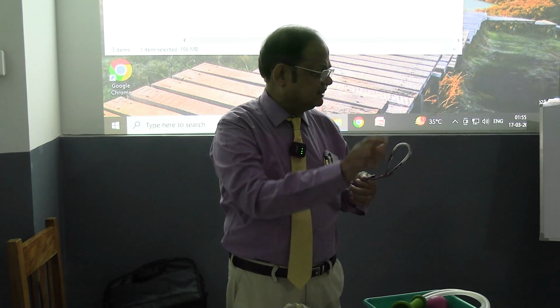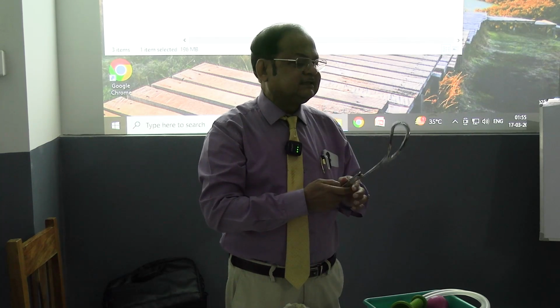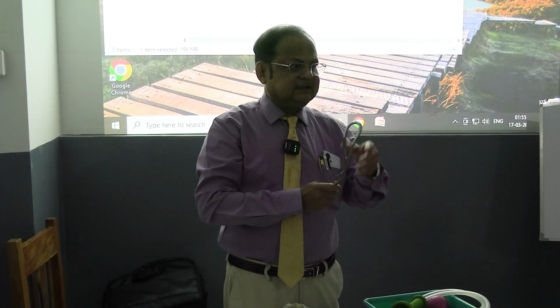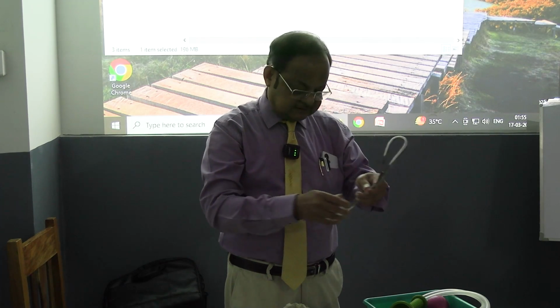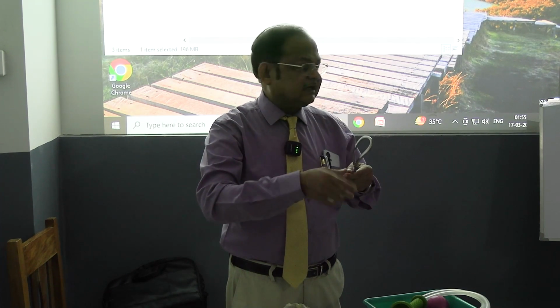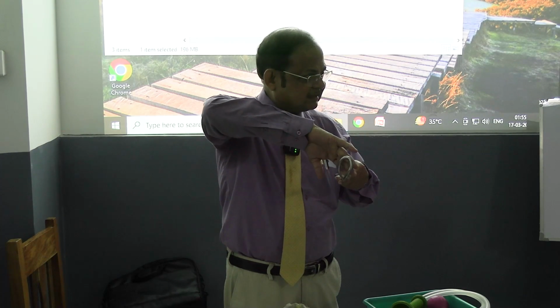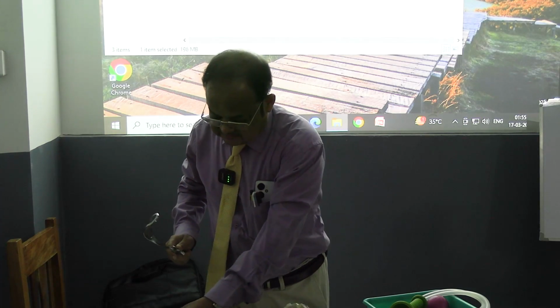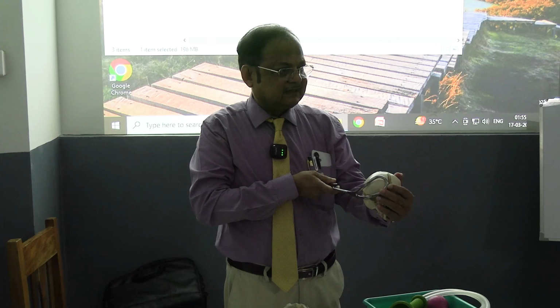Heel, that is the heel, and this is the toe. Another thing is that you will see the blade has a peculiar shape, because there are two curvatures. One is the cephalic curvature. This curvature actually fits with the fetal head, like this, the fetal biparietal curvature.